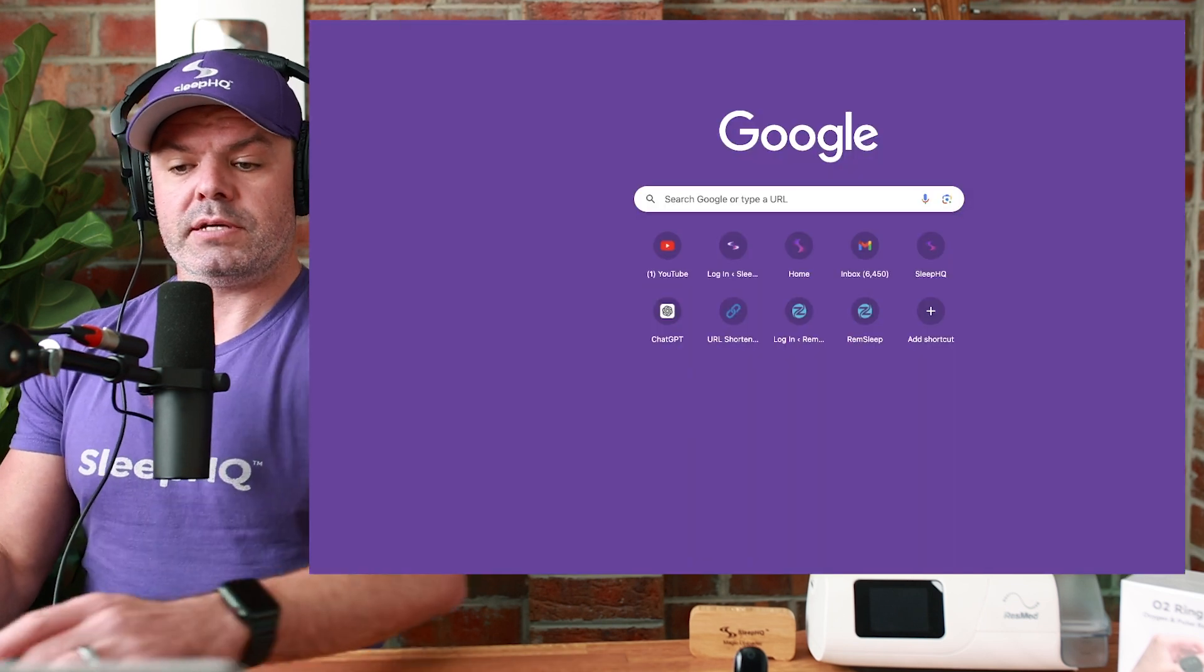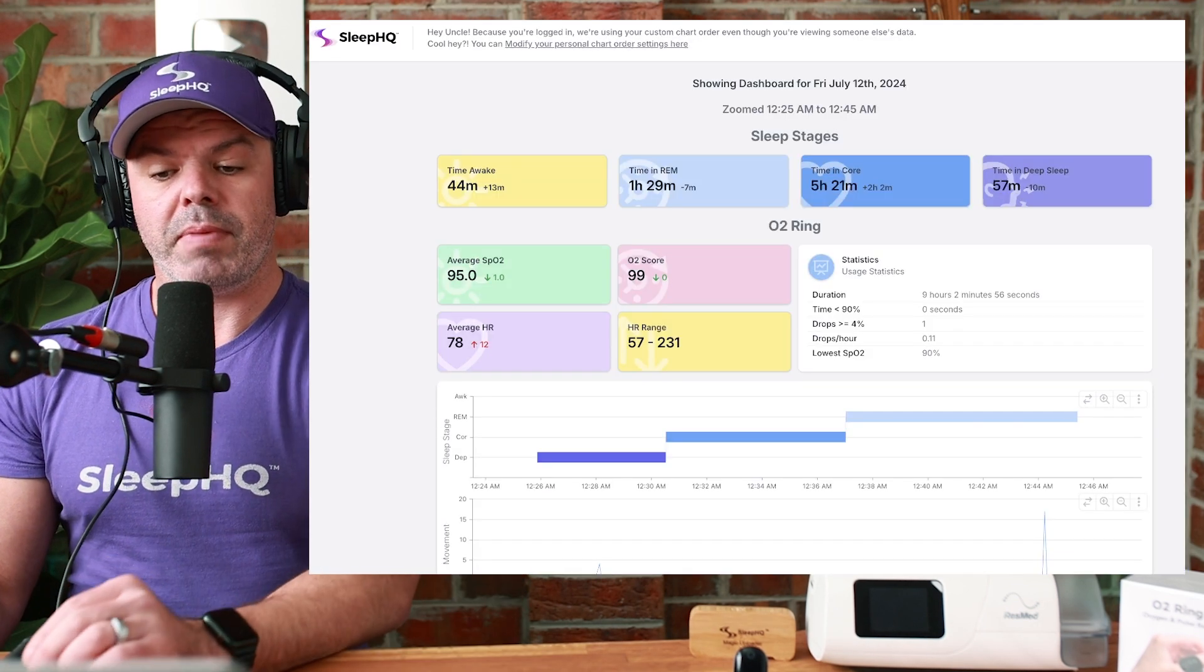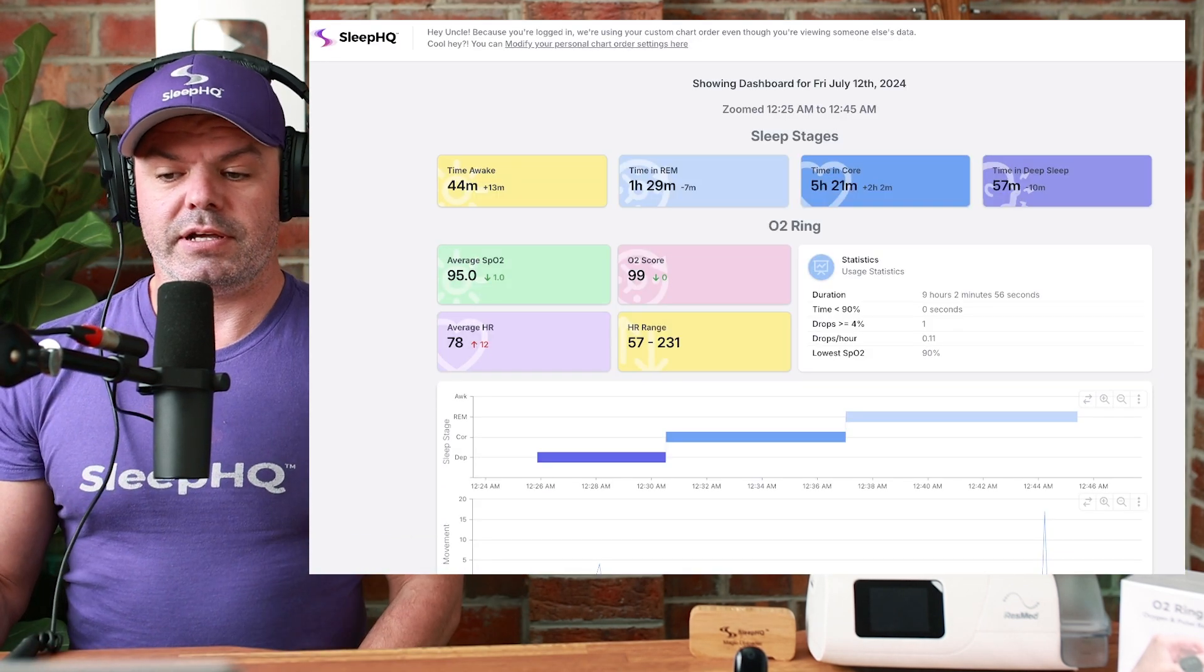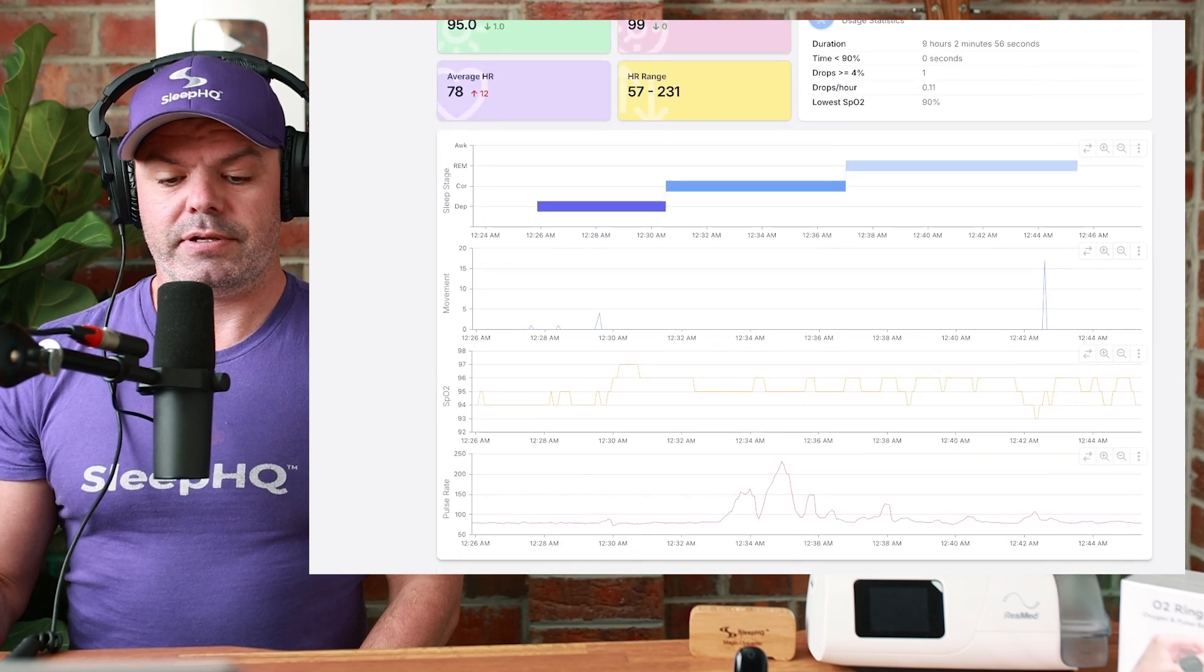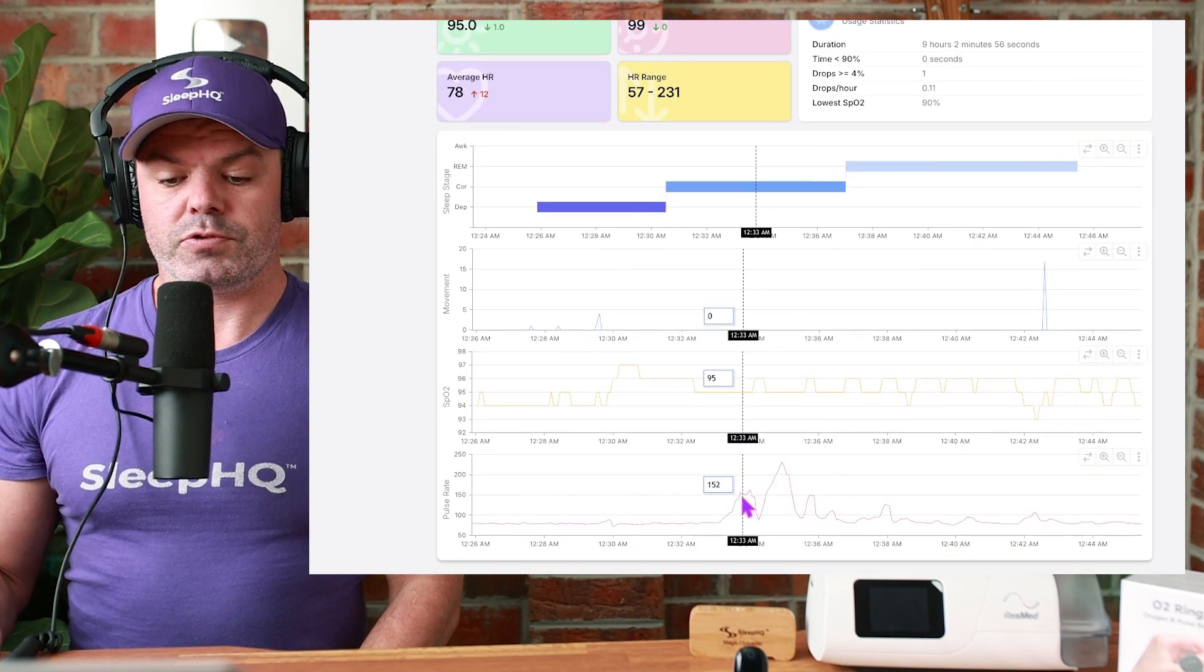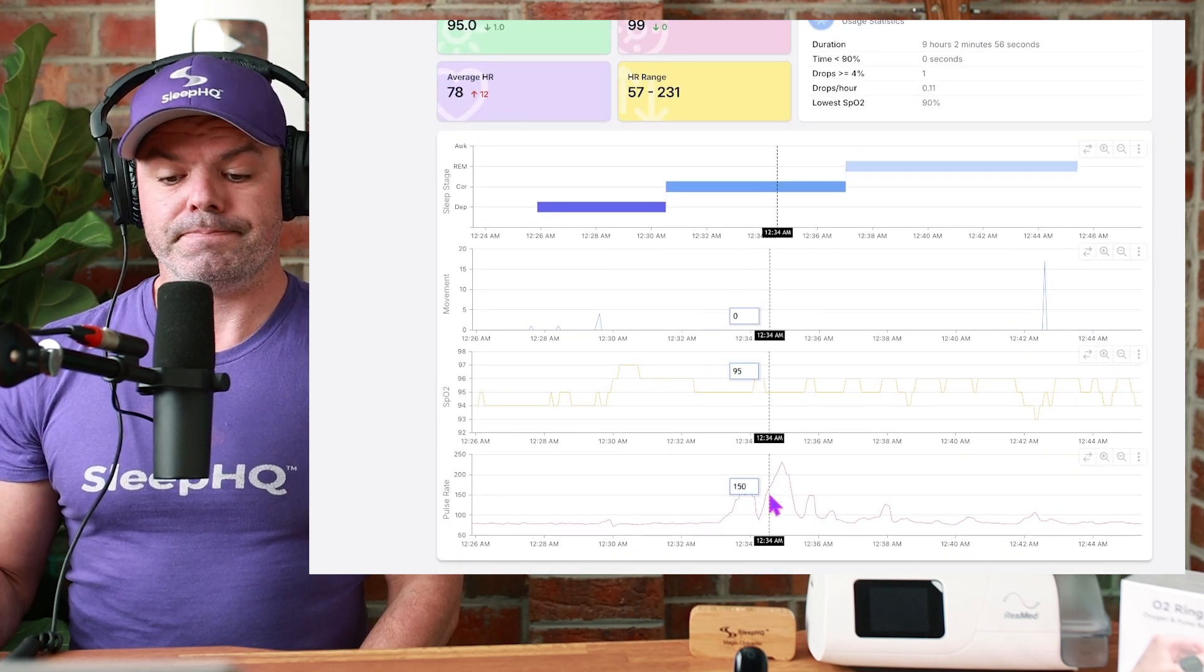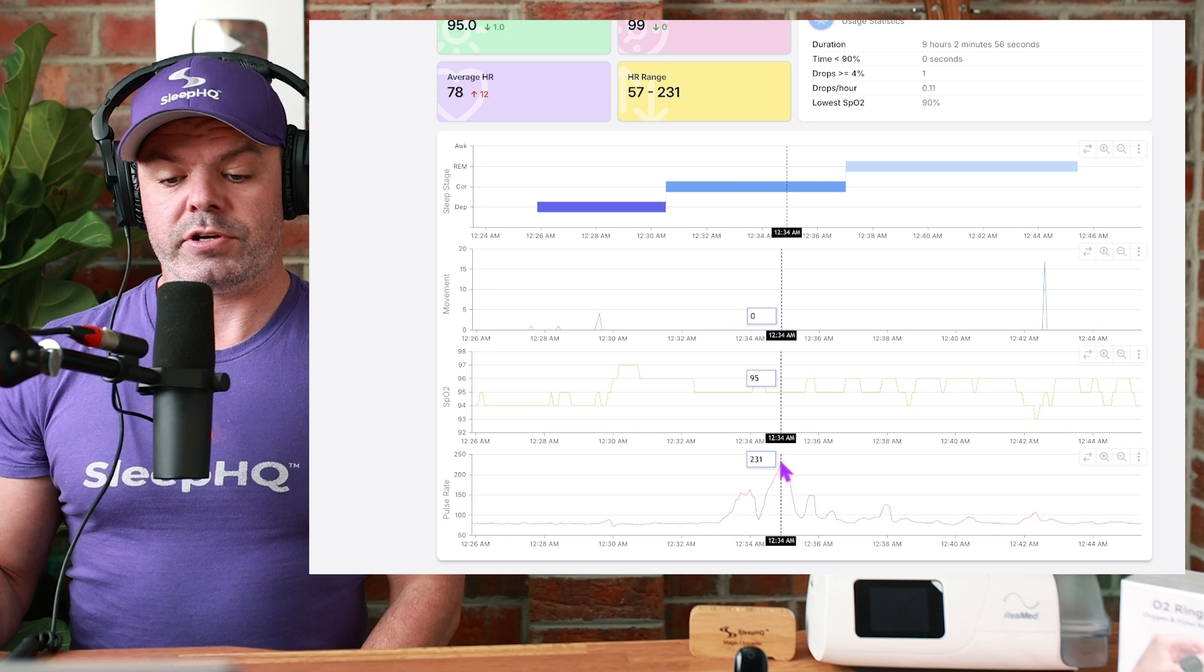Paste it into a browser, into a post, into an email. There it is. Come down here. There's the pulse rate that we just looked at. And there's Mount Everest.